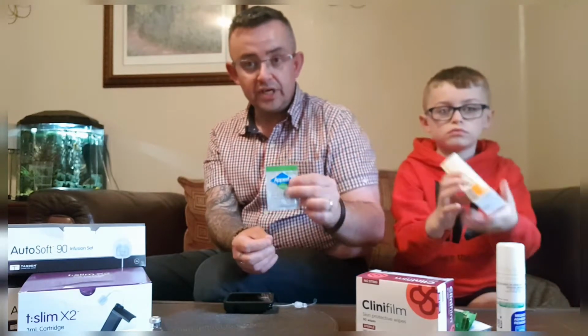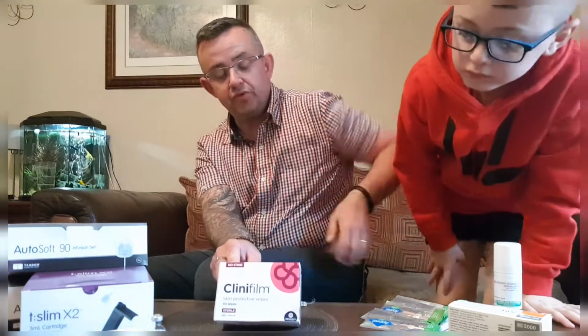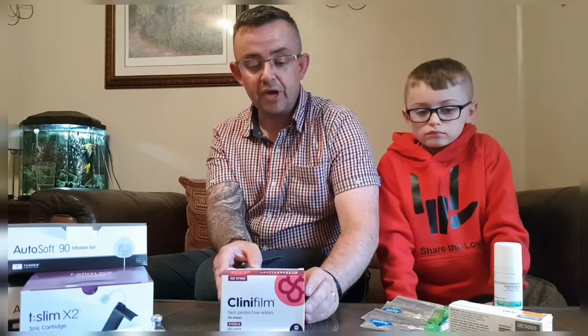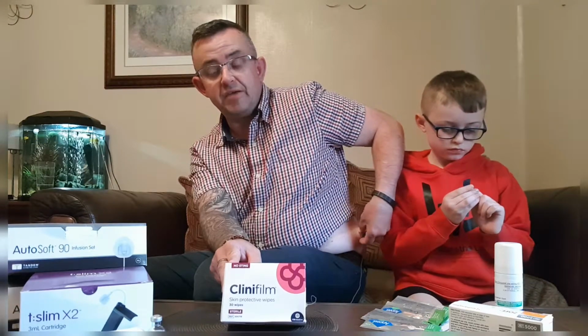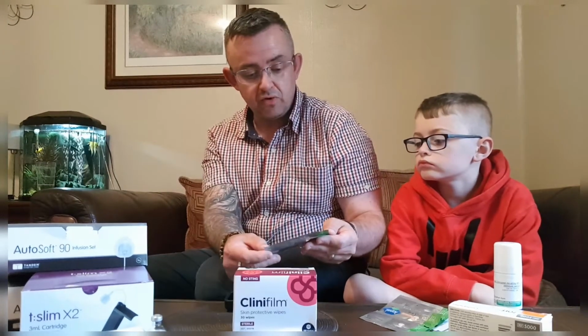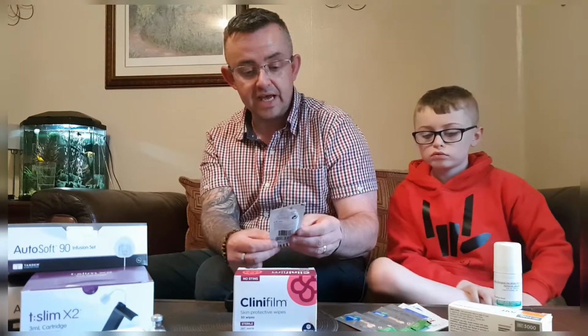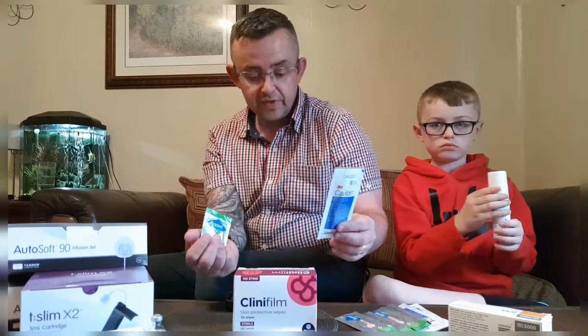Now, because I use these, I don't need to use these, but these are available. These are skin protection wipes, and once you've cleaned the area, and I've pre-washed where I'm going next, you can rub these on your skin first, and these will protect your skin or create a barrier for when you take it off. So if you find that when you take your cannula site off, it sometimes can irritate that much that it will pull some skin away, then these are good to use. There's Clinifilm, and also there's one which I haven't tried. No, sorry, Cavilon. That is a barrier film as well.